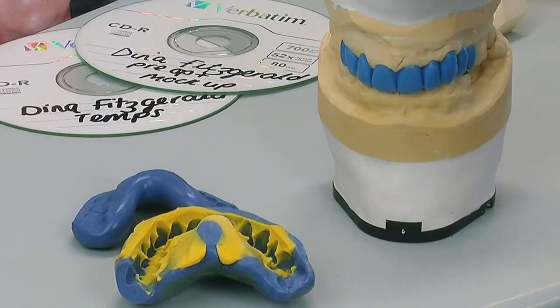With your temporaries they come off — it's absolutely precision crisp around the margins, which is fantastic. The other thing about it is it's not so hard that it breaks your temporaries, but it's soft enough to come off. You won't break your temporaries and even if you've got big undercuts it still comes out. Looks fantastic — the patient gets to see this, the dentist okayed it, and now we know we're good to go at our prep appointment.